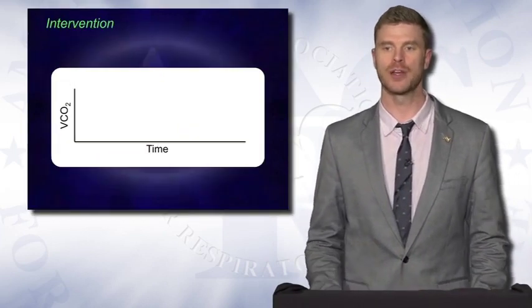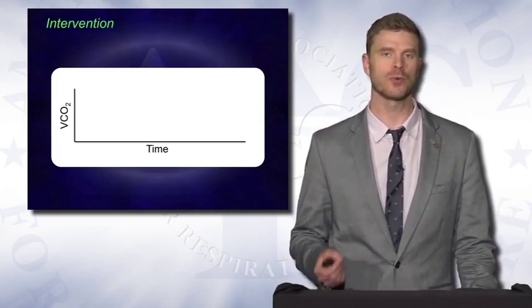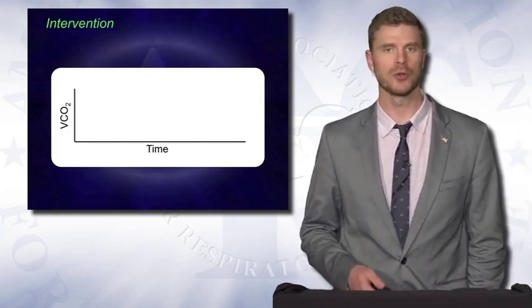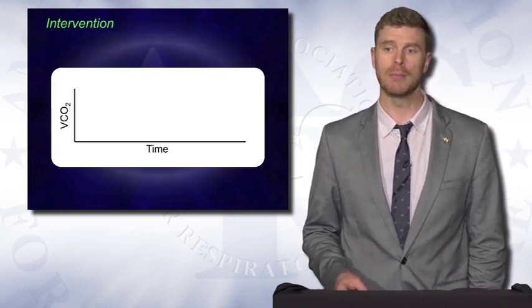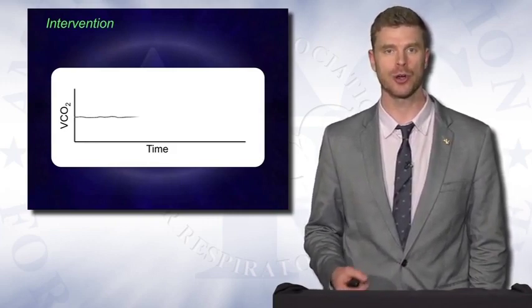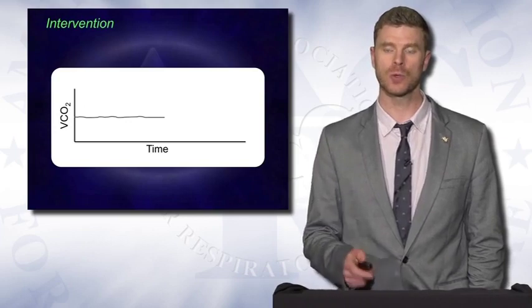Next, let's look at an intervention. So now instead of trying to titrate a specific parameter on the ventilator, what we want to do is just assess whether there was a positive or a negative response to some intervening therapy. The example that I'm going to use is perhaps inhaled nitric oxide in patients, which is off-label, who perhaps require it, or we suspect that pulmonary vasoconstriction is occurring, and alleviating that could improve the ventilation and oxygenation in our patients. So we look at our trend.